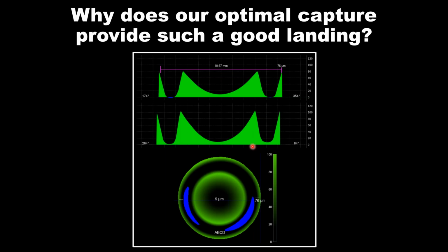And this lens is looking like it has really an ideal steep meridian relationship where you see that tiny fluid layer along the steep axis of the lens. That gives that contact lens very little room to tilt back and forth with the lid interaction. It gives that lens very little room to decenter because the lens to cornea relationship is relatively close. That lens should be on center. That lens should be relatively stable, which should increase the comfort level.